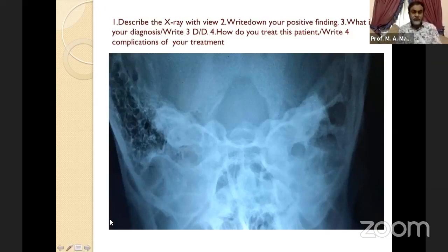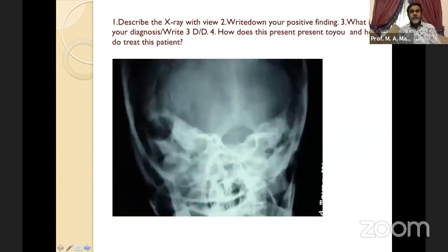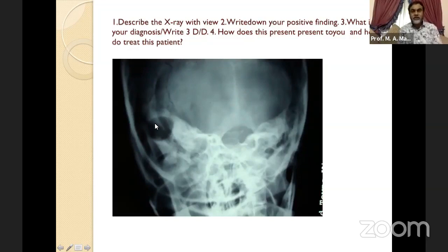Indication for radical mastoidectomy: malignant otitis externa, CSOM with intracranial complication, or cancer of the middle ear cleft. This is another similar X-ray — mastoid Towne's view showing a large circular radiolucent shadow in the right tympanomastoid region with a sclerotic margin; the left mastoid area shows multiple air cells like a honeycomb. Diagnosis: cholesteatoma in the right middle ear cleft.